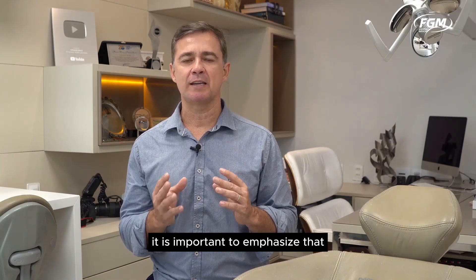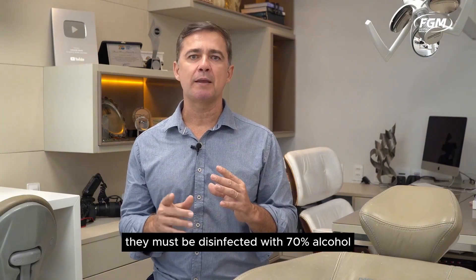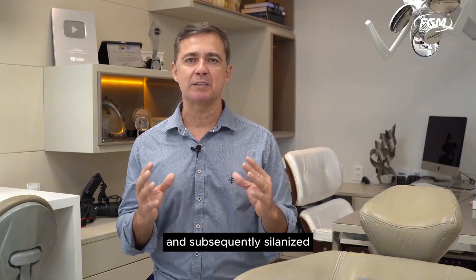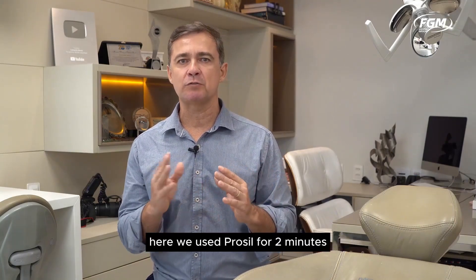It is important to emphasize that before cementing the posts, they must be disinfected with 70% alcohol and subsequently silanized. Here we used Prosil for two minutes.